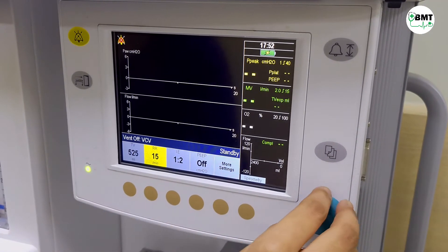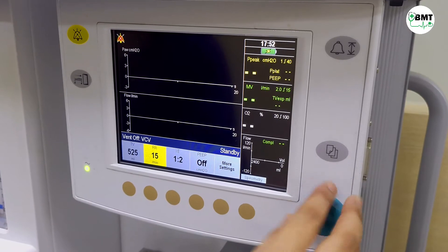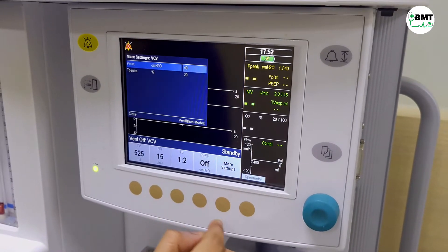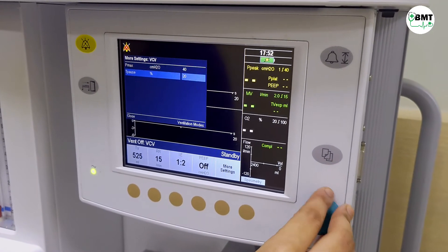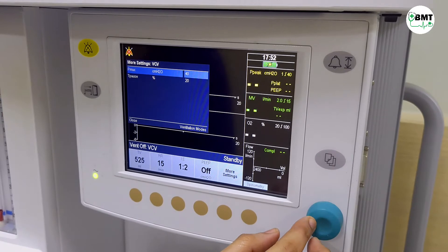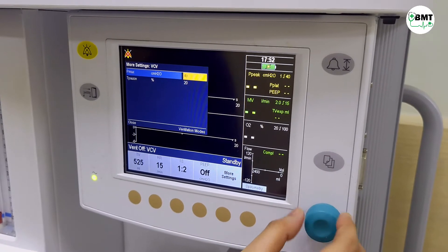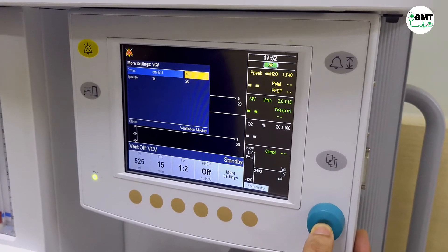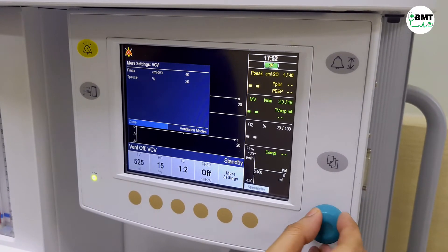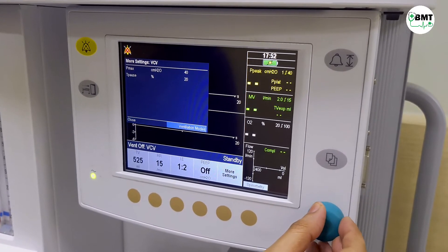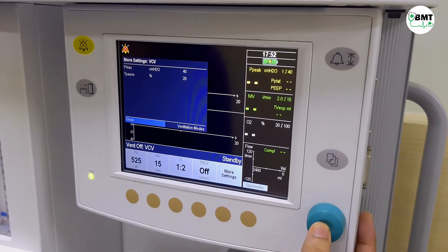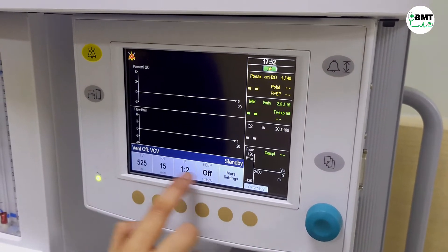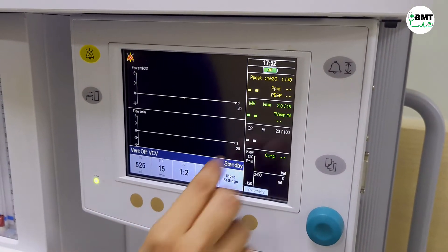To change a setting: increase or decrease using the knob, then acknowledge. Close. So these buttons are used to set these functions.